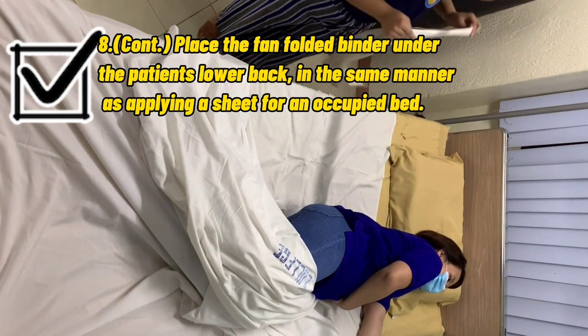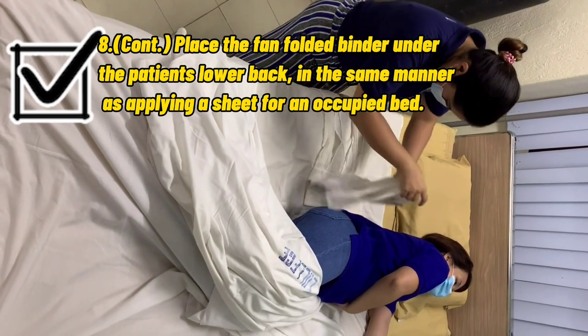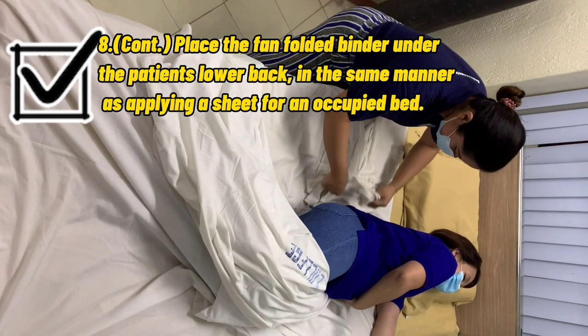Place the fan-folded binder under the patient's lower back in the same manner as applying a sheet for an occupied bed.